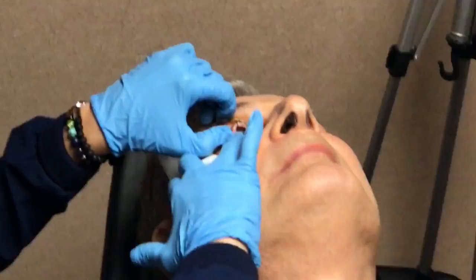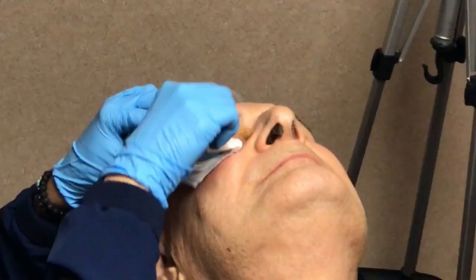Go ahead and look up, I'm going to take the clip out. Good. And then we make sure to wash out the betadine and clean the eye — to help minimize any irritation afterwards, as the betadine does initially irritate the surface. But Tanya does a great job of cleaning around the eye and washing it out to help avoid that irritation afterwards.